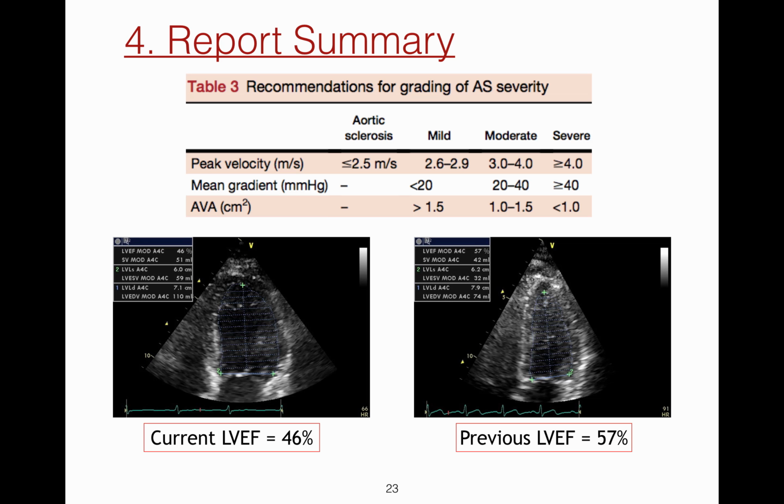Secondly, include specific positive or negative findings. For example, if the images and measurements indicate a definite improvement in function, include a description supported by measurements that indicate this. Or, if in the example provided on the screen, the images and measurements indicate a definite deterioration, include a description supported by the measurements that support this.